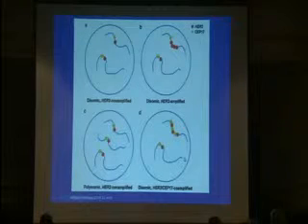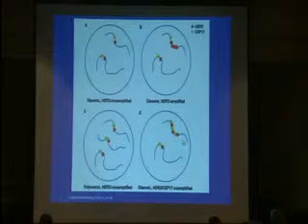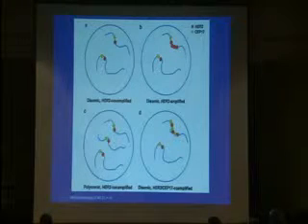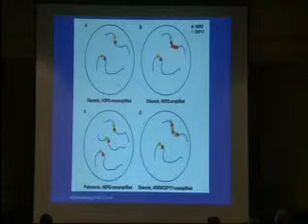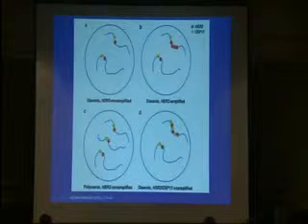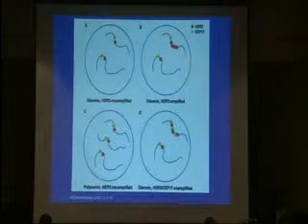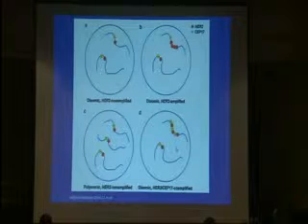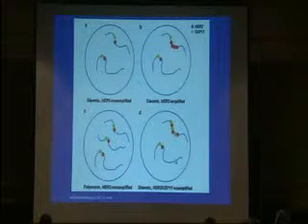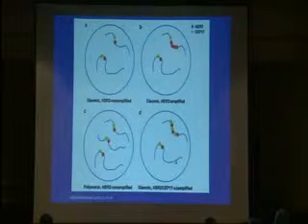However, look at D here. We have 2 chromosome 17, which means it's disomic. But one of them shows 3 green signals and 3 red signals. So obviously, this chromosome has amplification of both HER2 and CEP17. But if you calculate the ratio, how many greens do we have here? 3, right? How many reds? We have 3. So the ratio will come back non-amplified.